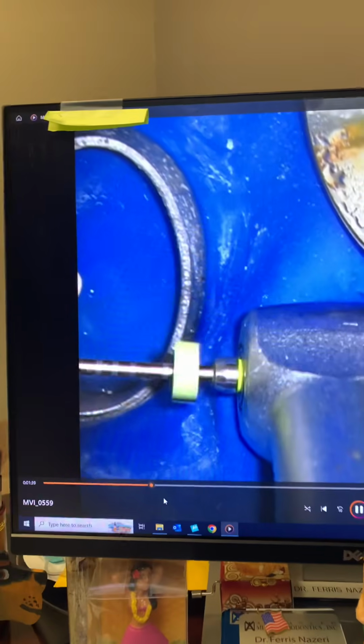So here goes the first NiTi file. These are E-Flex S by 8 Teeth.